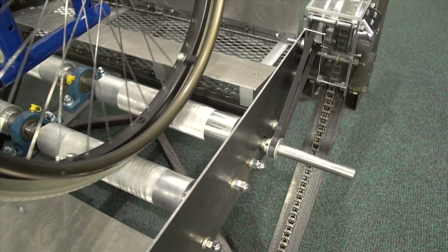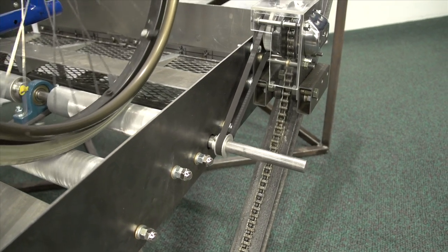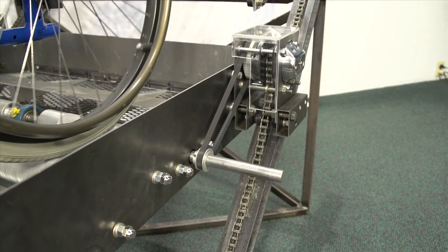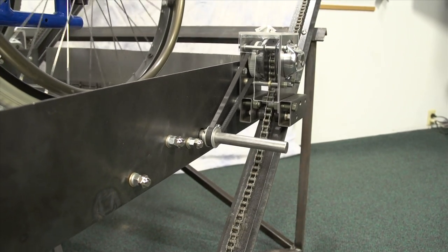The concept of the funicular is basic in principle. As a user rotates their wheels, they engage the rollers. The back roller then drives dual belts which are connected to modified chain hoists, and the chain hoists utilize a rack and pinion setup to travel up and down the rails.